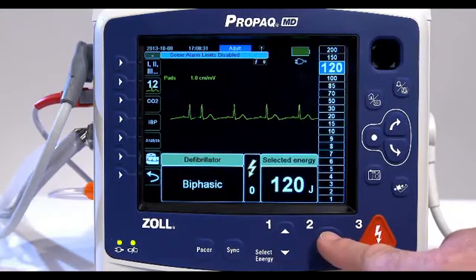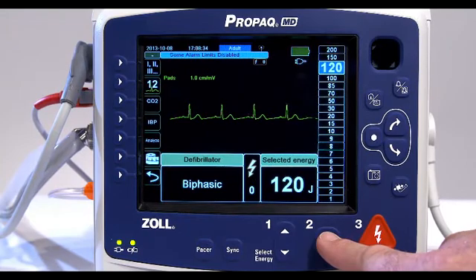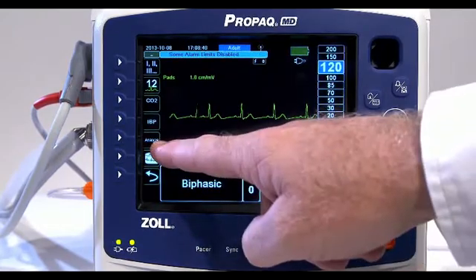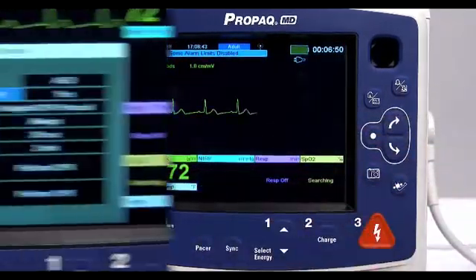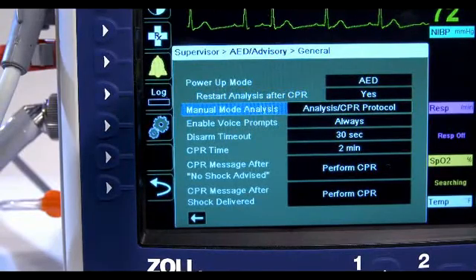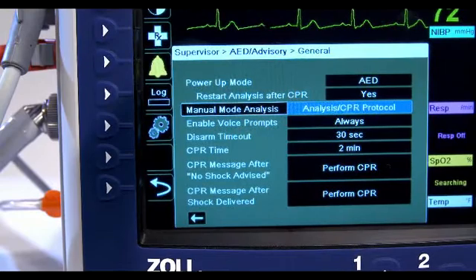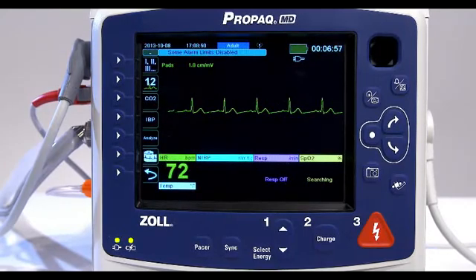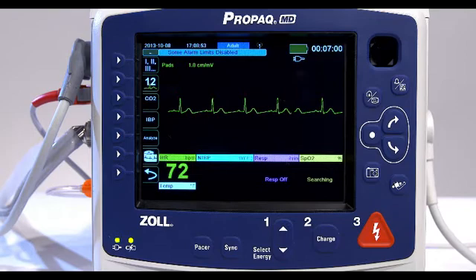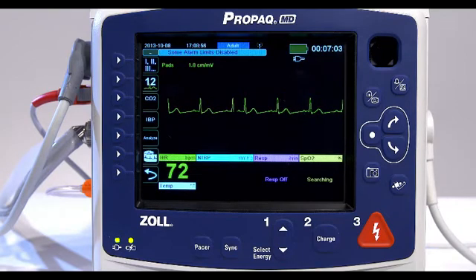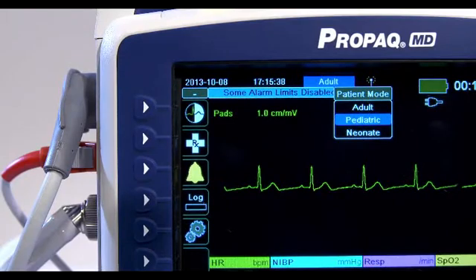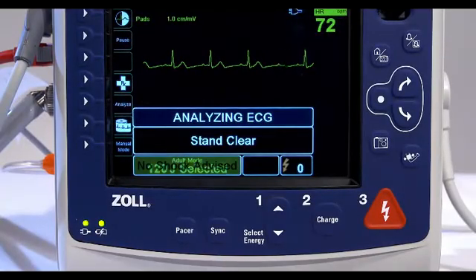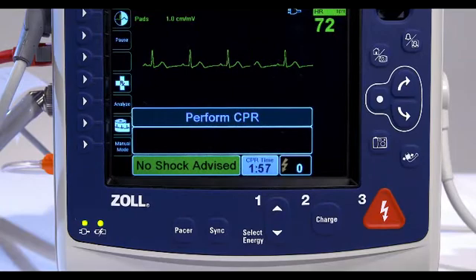If you press the energy select up or down arrow keys, or the charge button while in advisory CPR protocol mode, the unit transitions to manual mode only. The advisory CPR protocol function can be activated only when the unit is configured for analysis CPR protocol. The unit must be on and in manual mode, hands-free therapy electrodes properly connected to the patient, valid impedance detected, PACER off, and the patient mode not set to neonate. When a non-shockable rhythm is detected, the unit displays a No Shock Advised message.